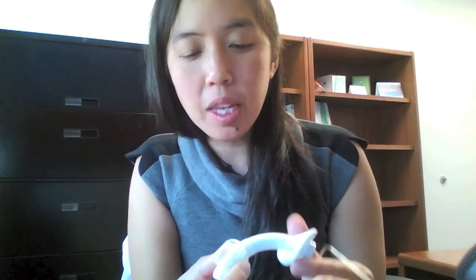Do you know what the purpose of the cuff on a trach or an endotracheal tube is for? The purpose of the cuff is to create a seal. When you have a patient who's being ventilated, they are on positive pressure ventilation. You're blowing air into their lungs. The air from your ventilator is going to want to take the path of least resistance, which in general is going to be back out through the mouth or through your trachostoma. So you inflate your cuff to help create a seal with the trachea to prevent the air leak back out your mouth. That's what the purpose of the cuff is for.